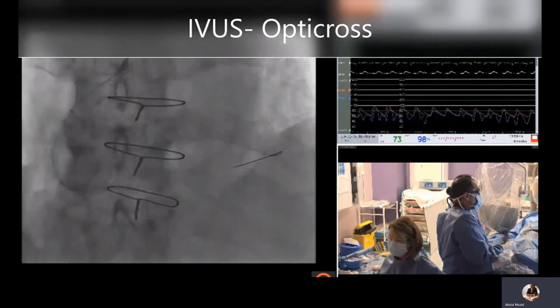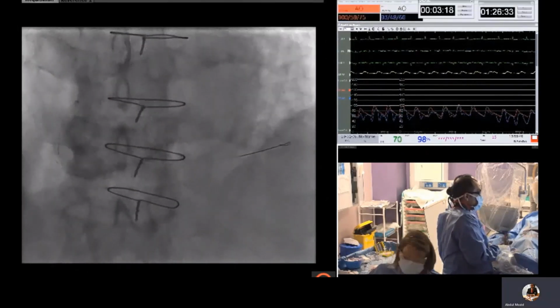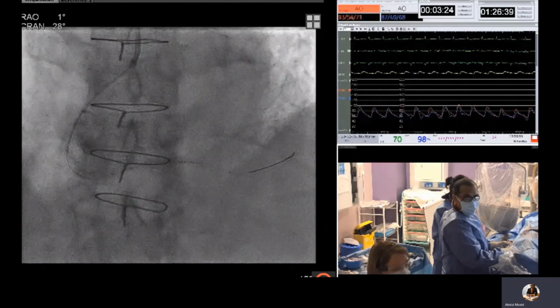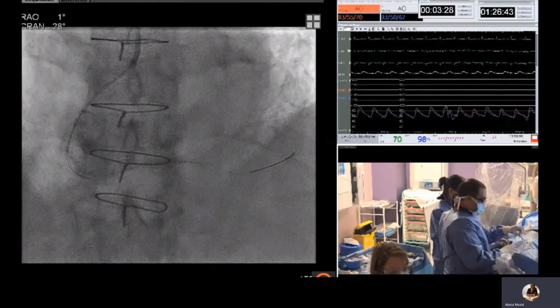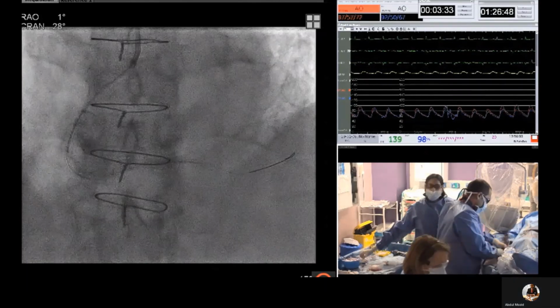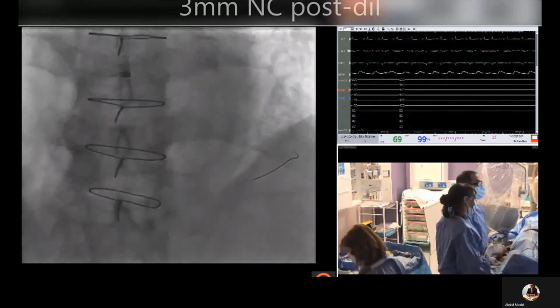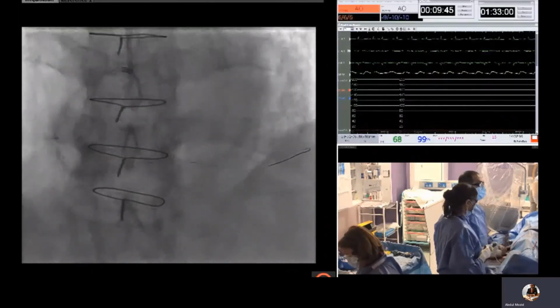Following this, we performed repeat imaging to guide us on the need for further optimization, and this in fact revealed a slightly underexpanded stent in the distal PLV, requiring further post dilations, in fact with a 3 mm NC balloon. And this was then a 3 mm NC in the PLV branch at high pressure.